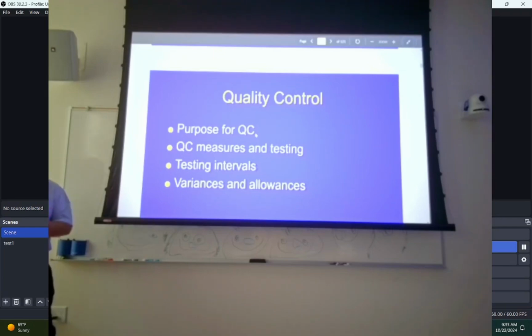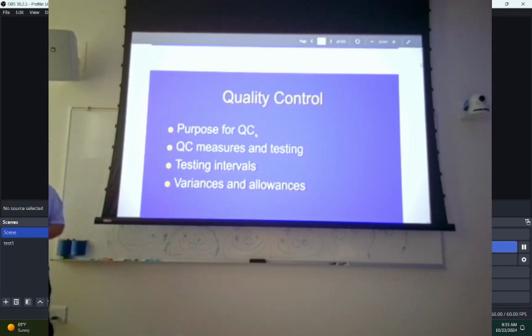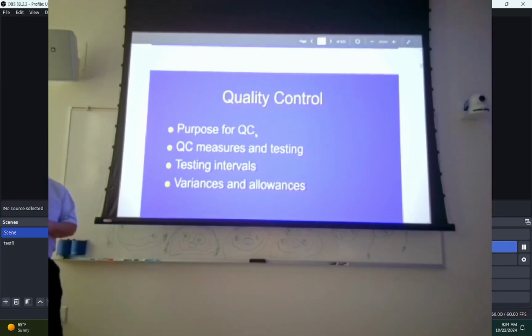And then once they put it in, they're going to run some tests on it, and they're going to test everything. Is it shooting with the right kVp, mA, or is the mA station accurate, or the timer accurate? Is the beam shooting perpendicular, or is the collimator right? Everything gets tested, and then we sign off on it. That's what we refer to as acceptance testing. And if we were in a hospital where we were making images on people, live tissue, then every year they would have to come in and test all that stuff over and over again, at least once a year.